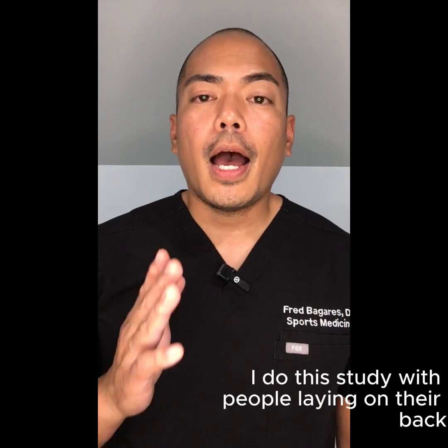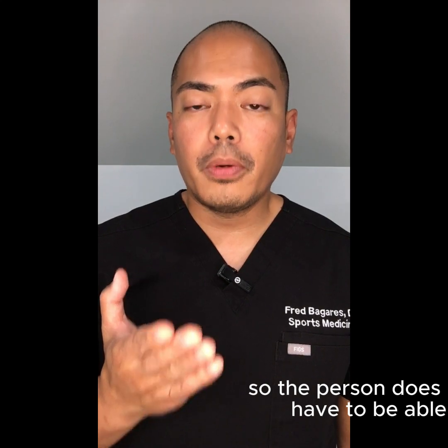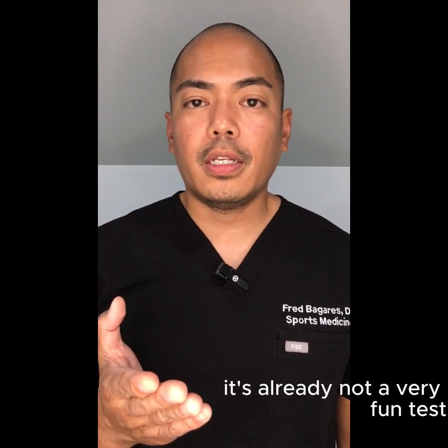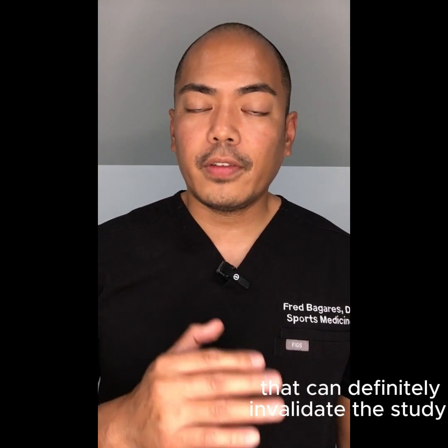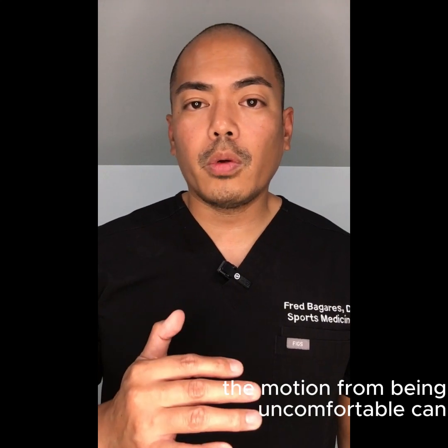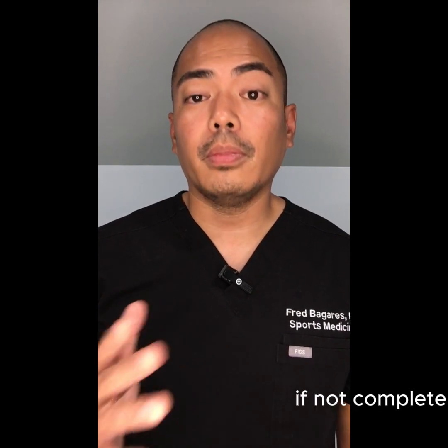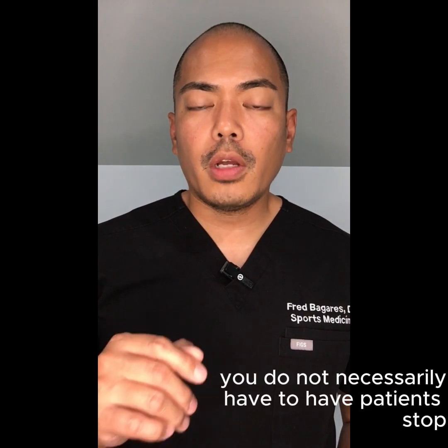That being said, I do this study with people laying on their back. So the person does have to be able to tolerate being in that position for about that amount of time. It's already not a very fun test, but if it's very difficult for them to relax and be on their back, that can definitely invalidate the study, because the motion from being uncomfortable can cause a lot of artifact, and it can sometimes make the study very difficult to interpret, if not complete.